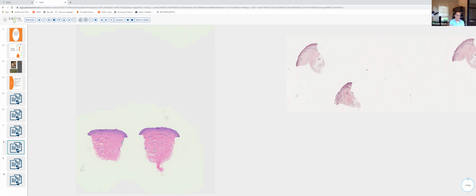The interface dermatitides are a lot more alike in many instances than they are different. And that's obviously the similarity between these two conditions. They're both interface dermatitis, fixed drug eruption and EM. They're both characterized by vacuolar change along the DEJ. They both are characterized by necrotic keratinocytes within the epidermis, and they both can demonstrate varying amounts of spongiosis and ballooning of the epidermis, even leading to intra- and subepidermal blister formation, depending upon the age of the lesion.